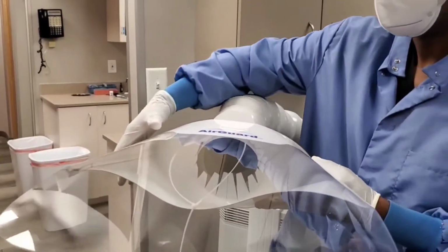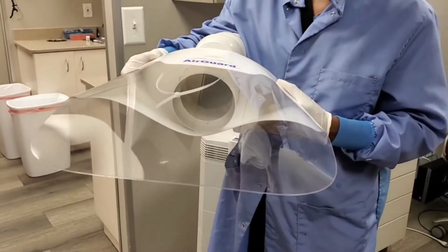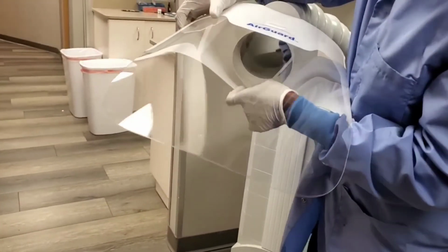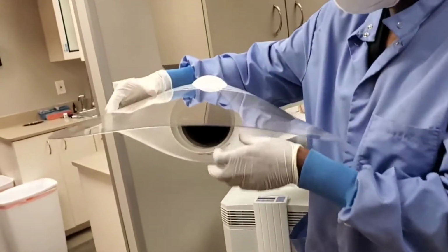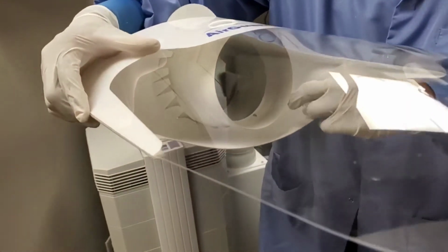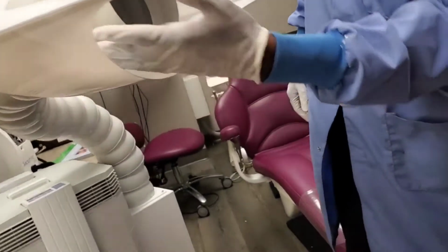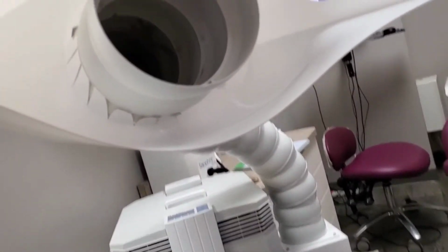Very simple. I like to use two hands and slide it on easy, and then you'll hear it click sometimes, like you just heard. And then once you do that, then you want to bring this down, like so. And voila, you have it on. And all you got to do now is close down the zip tie to lock it. So now you have it locked on with the zip tie, and then the clamps have clamped on to the rivet of the dental tube.